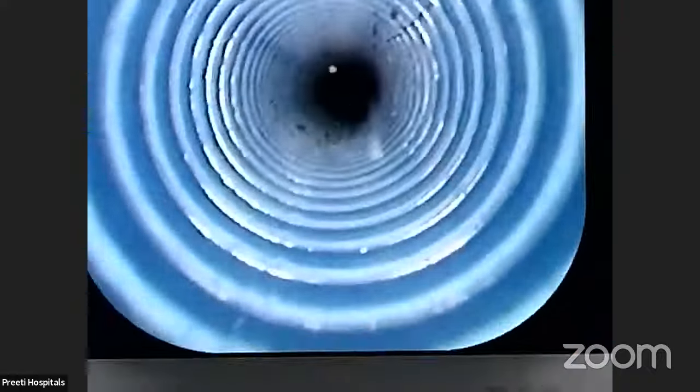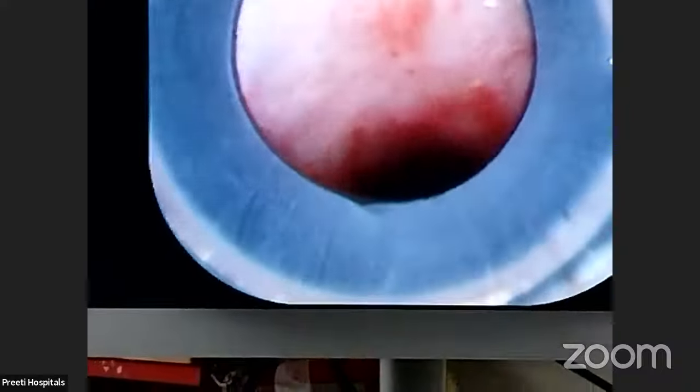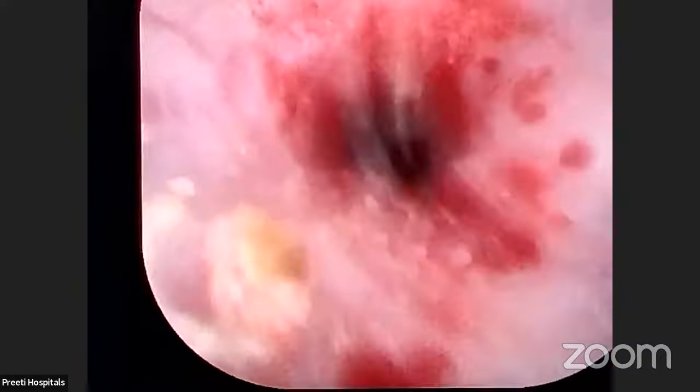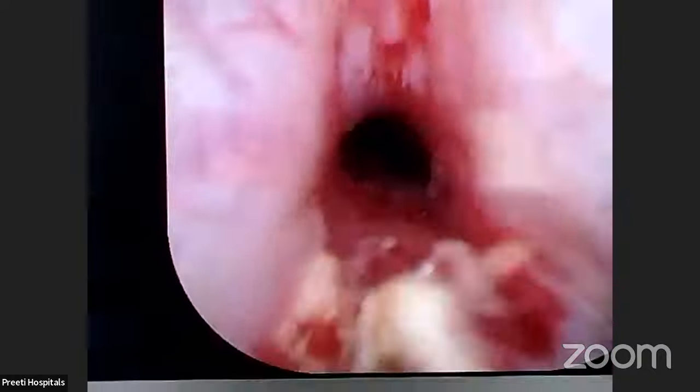See, now you go inside. You are in the upper calyx. See, this is the upper calyx. Now I will come back. You are in the upper calyx like this. Suck it out, all the powder and everything, sir. Yeah, this is the middle calyx. See how it is sucking out.